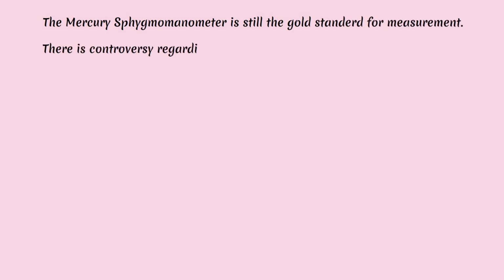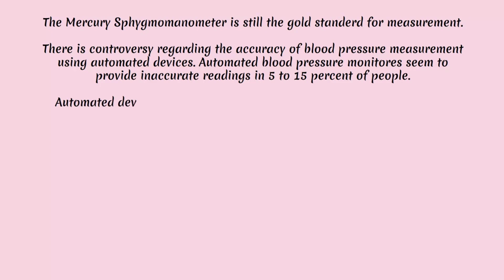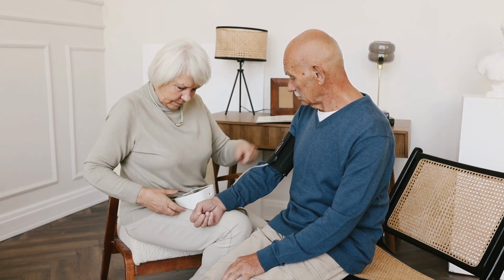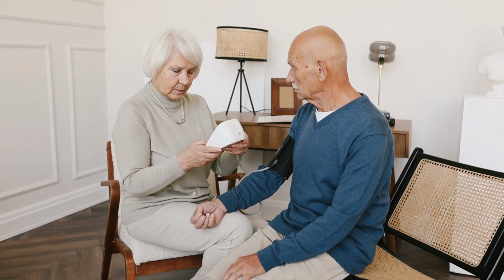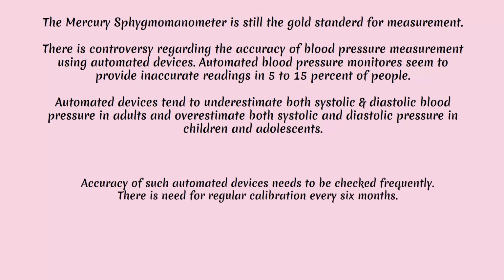There is controversy regarding the accuracy of blood pressure measurement using automated devices. Automated blood pressure monitors seem to provide inaccurate readings in 5 to 15% of people. Automated devices tend to underestimate both systolic and diastolic blood pressure in adults and overestimate both systolic and diastolic pressure in children and adolescents. Accuracy of such automated devices needs to be checked frequently. There is need for regular calibration every 6 months.